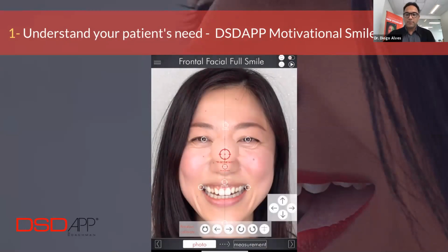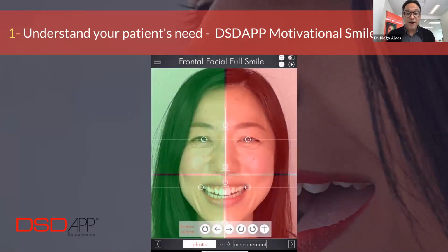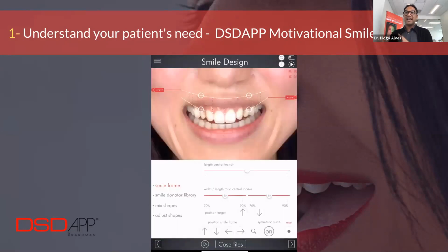As I was saying before, the way that we start is by communicating with the patient. And there is nothing better than communicating with the patient and showing them what could be done. And the best thing is that you can have them become a co-designer of their own smile. So as you guys can see here, and this is in real time, you will be analyzing the facial structures, which we call the facial flow concept. And then you will go and set the smile frame.